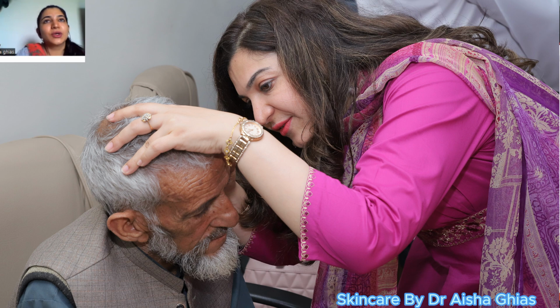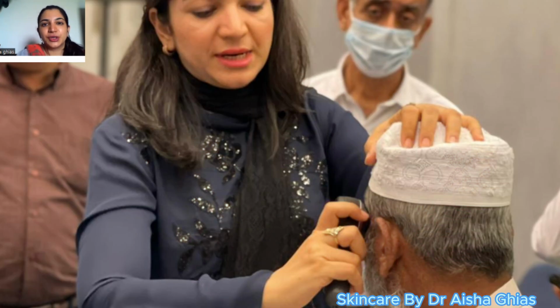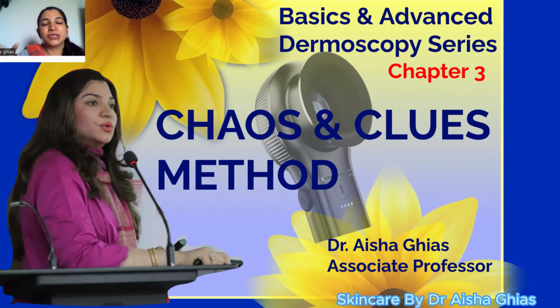And sometimes not only do we isolate benign from malignant cases, but we are ourselves very sure that whatever diagnosis I'm working on is actually likely or not likely. And sometimes it's so very useful in the cases of alopecias that you instantly know whether I'm dealing with alopecia areata or androgenic alopecia or telogen effluvium, which we do not know apparently just on the clinical examination sometimes.